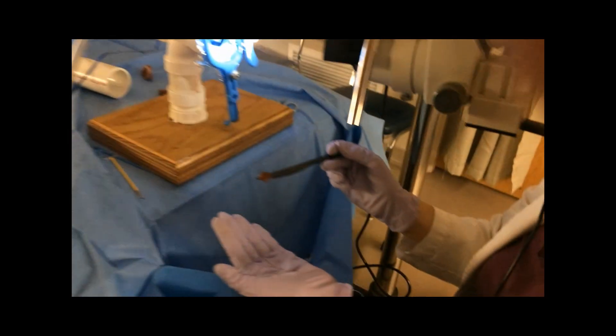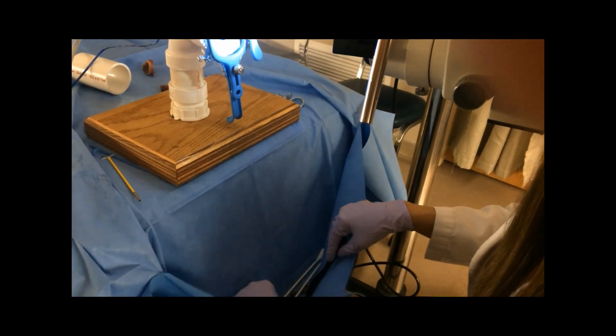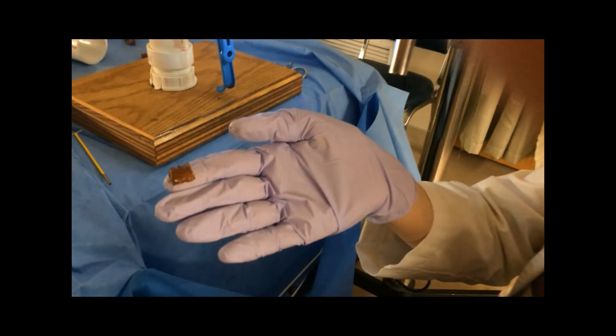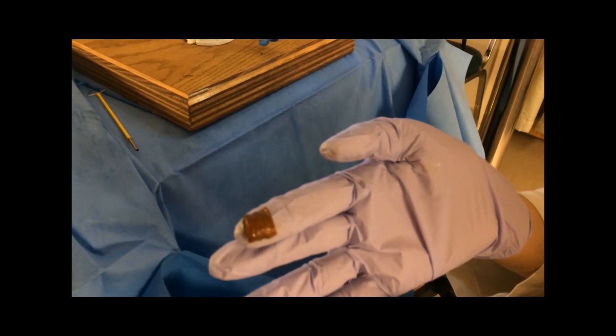I'm very happy with that specimen. This is just where I excised from what would be around the cervical os to give me more insurance that I had gotten everything I needed to get.